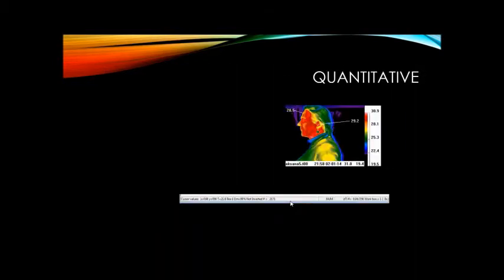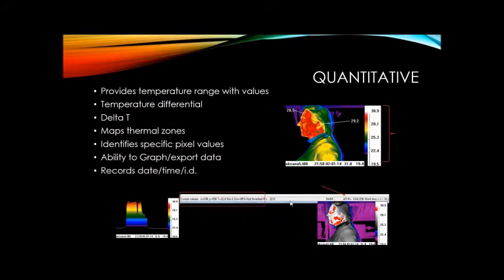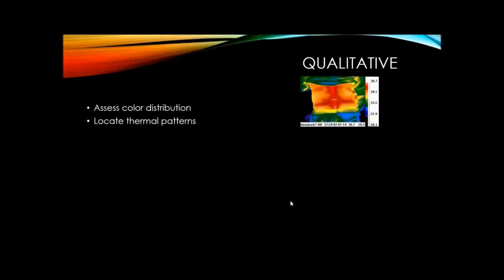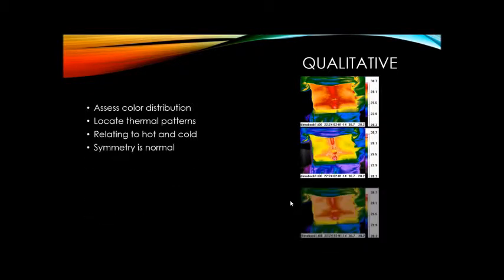Learn about the quantitative features of an infrared camera and the associated software, and how this relates to human and animal imaging. We present details on the qualitative aspect when it comes to reading and interpreting the image. Software processing plays an important role here as well.